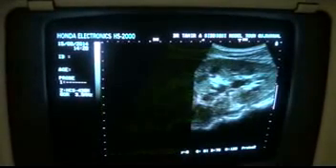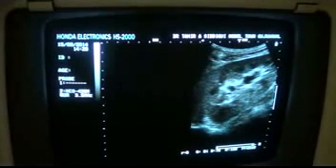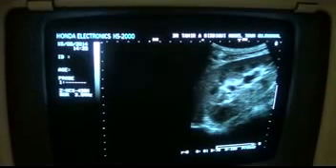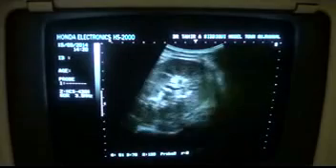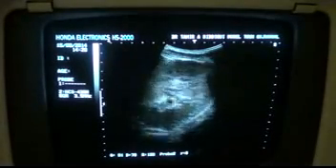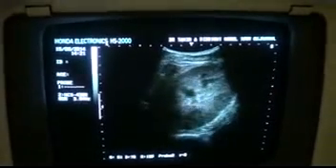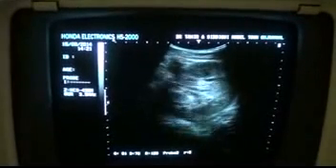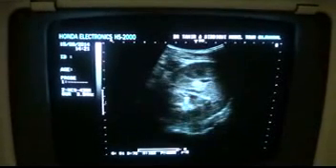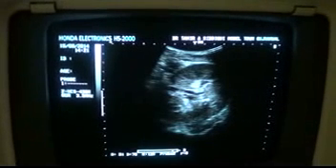Okay, so this is the urinary bladder and the prostate is normal. There is no finding in that region. This is the transverse section of the left kidney, with patent hilar region vessels. Okay, now this is our case of the day. Thank you very much.